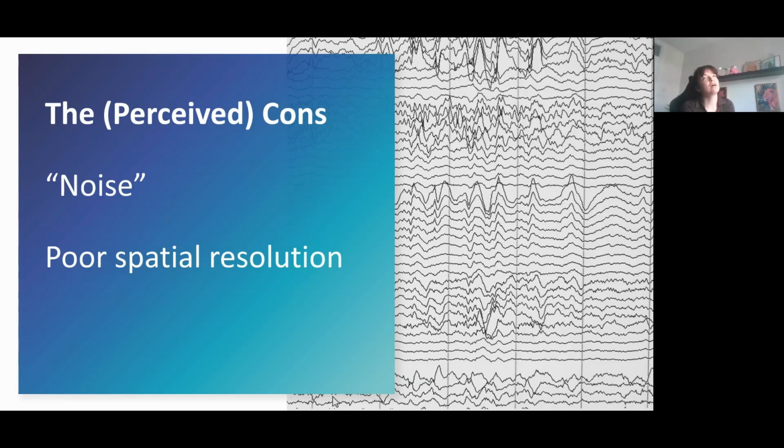But what I will say is that a lot of people are more familiar with the classic old style of looking at EEG where the raw EEG signal is read. Whereas what we're largely talking about is quantitative EEG, where we will record the signal and we can very readily apply processing pipelines, which will help to disentangle any noise there is in the signal from nice, clear EEG signals. So that's not really a concern. And of course, alongside that, we can design and test protocols that minimize any kind of environmental noise and maximize the quality of your signal to begin with.